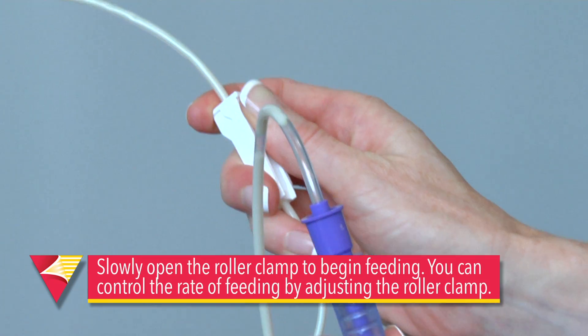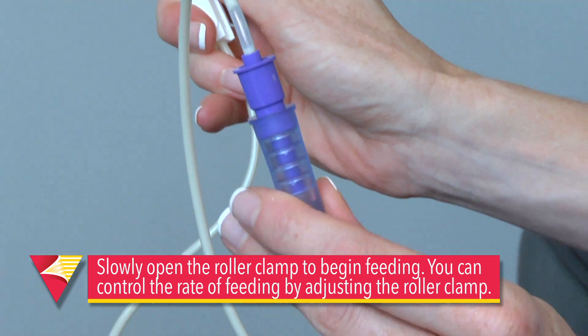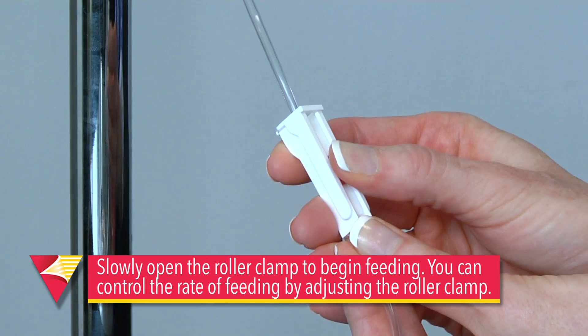Now you'll attach the tip of the tubing to your feeding port. Slowly open the roller clamp to start feeding. You can control the rate of feeding by adjusting the roller clamp.